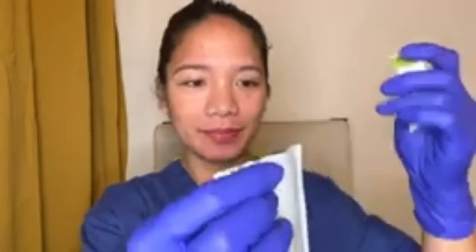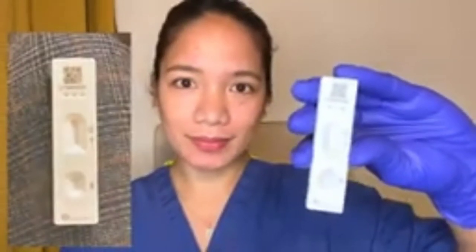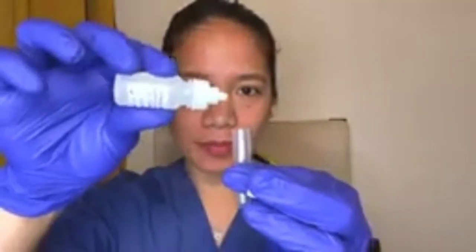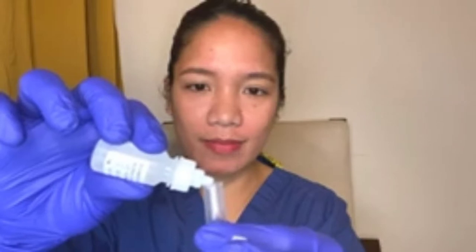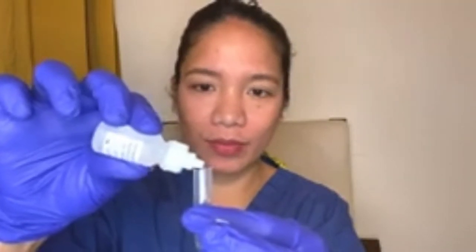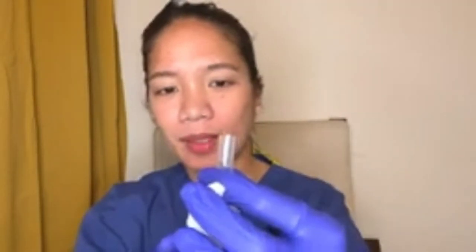Let's open the cartridge and put it on a flat surface. This is how it looks. Then take the tube and pour at least 6 drops of the solution inside the tube. You always have to keep this tube in an upright position — avoid spilling the solution.